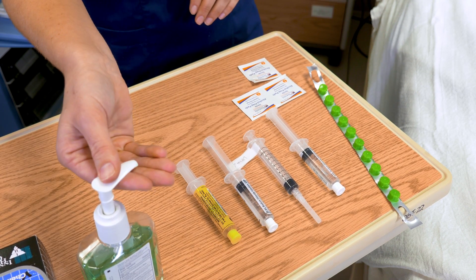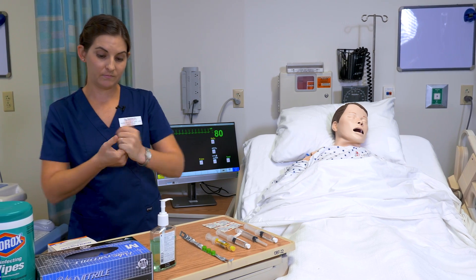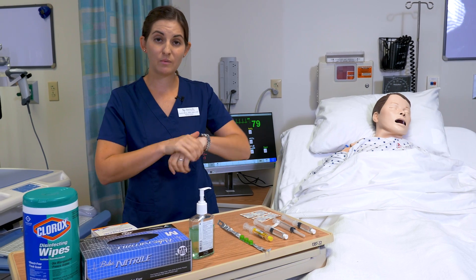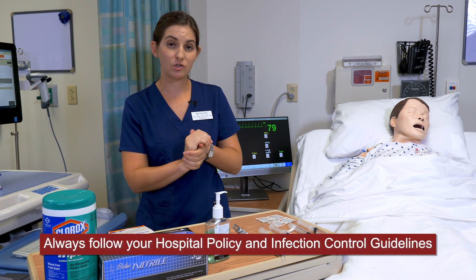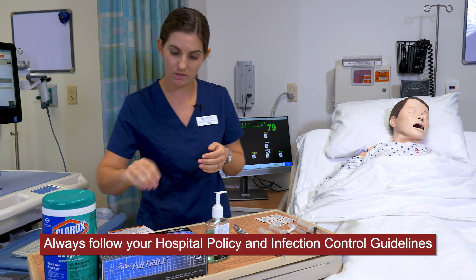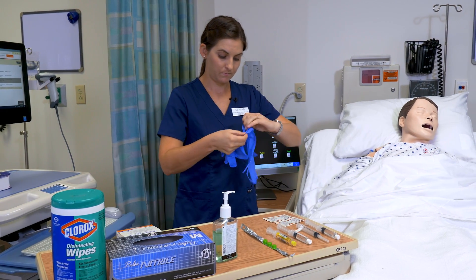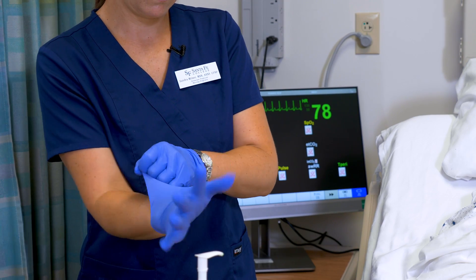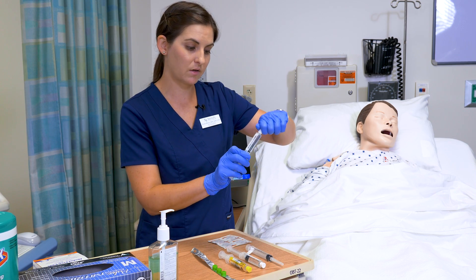I'm now going to go ahead and wash my hands. I have explained to my patient what medication I have for them. I have double checked my drug guide, so I'm following all of my eight rights of medication administration. I'm going to check to make sure each of my syringes does not have air in them.